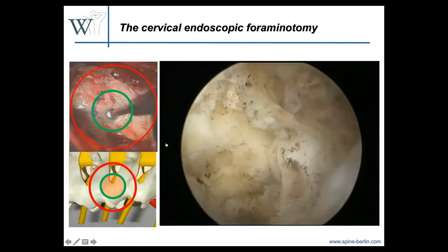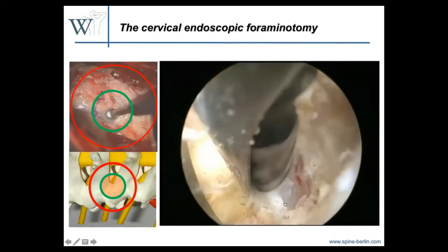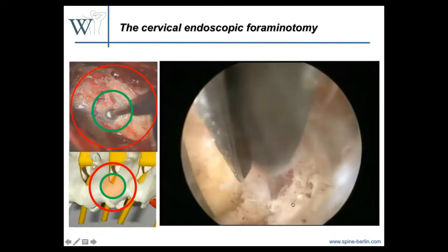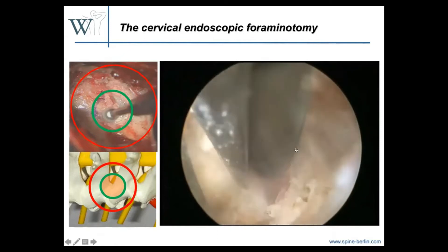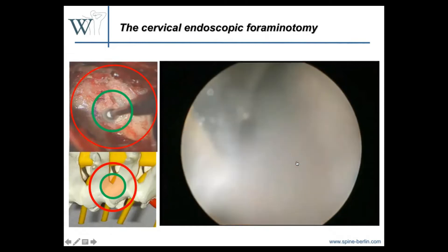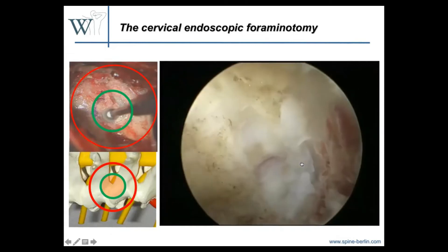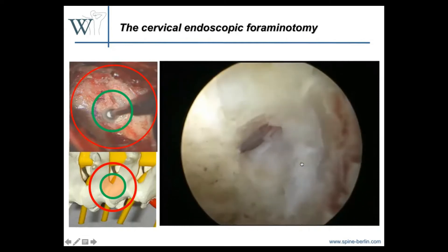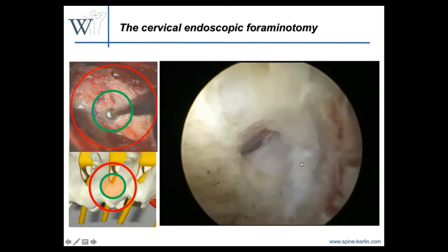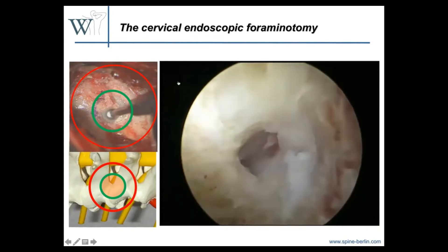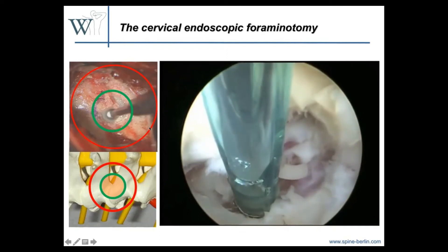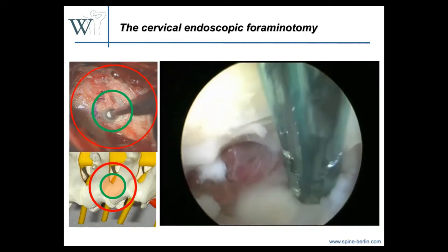We have the flavum ligament and the lamina here, and the facet joint would be here. We start to drill a little bit off the lamina with the oval burr, then we can use scissors to open the flavum — just like in lumbar endoscopic disc surgery. We minimize the approach to this area of interest, so we don't need to expose the other structures as we typically do in microscopic surgery.